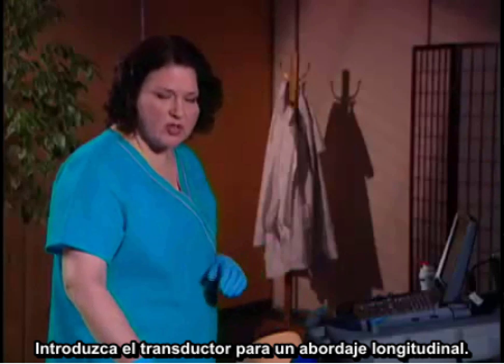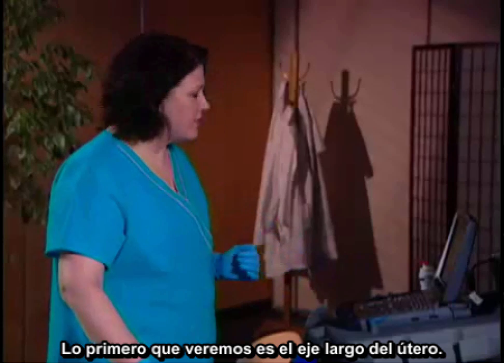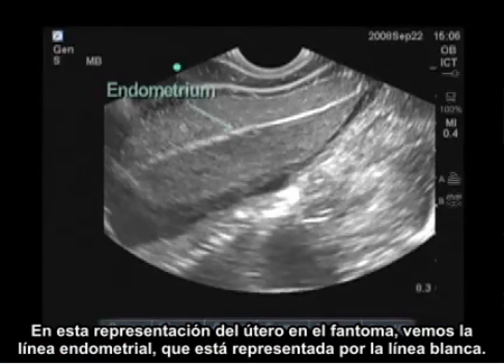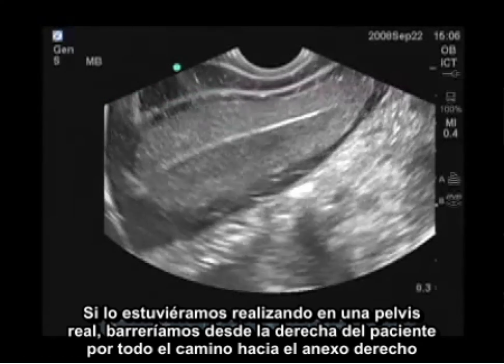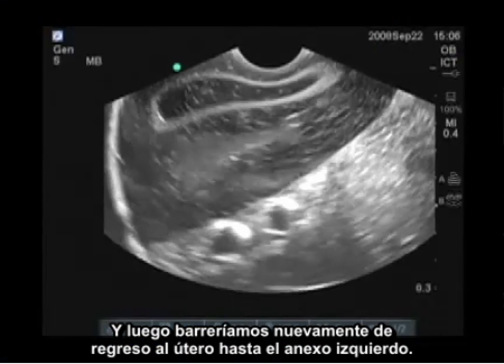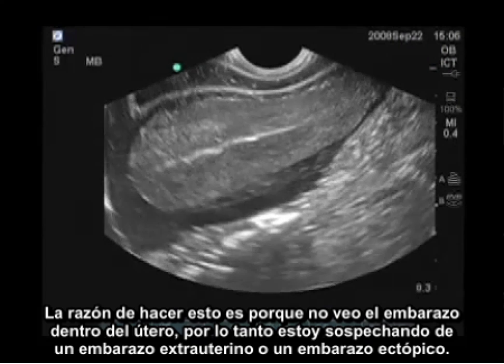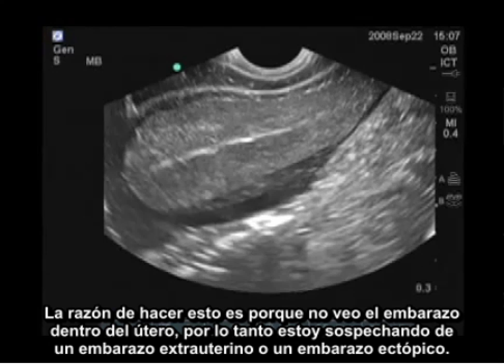After inserting the transducer in a long axis view, the first thing we're going to see is a long axis of the uterus. In this phantom, we see an endometrial stripe represented by the white line. I would scan to the right of the patient all the way through to the right adnexa, and then back over all the way through the uterus to the left adnexa — because I don't see a pregnancy inside the uterus.